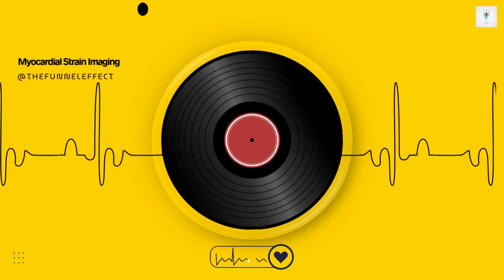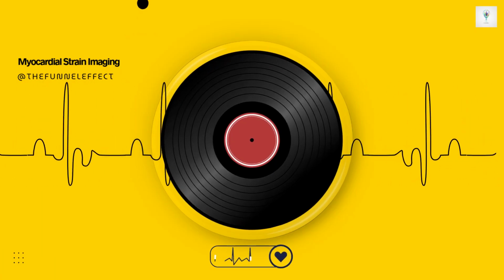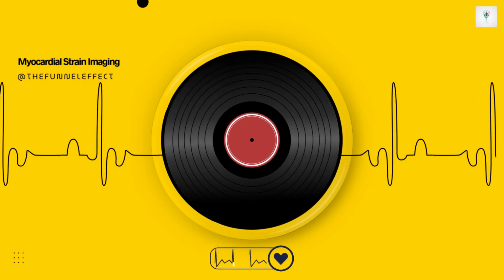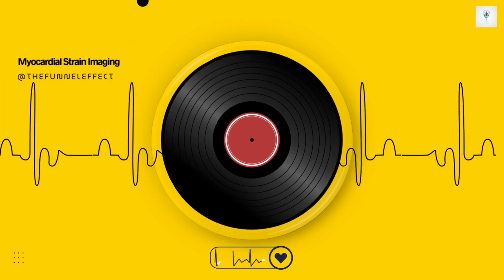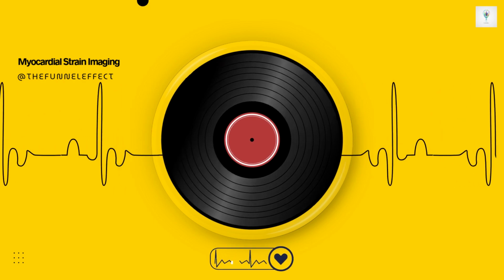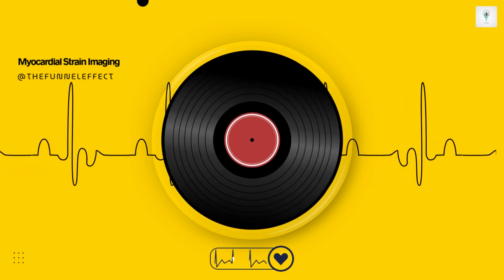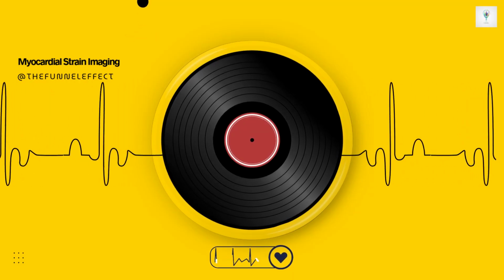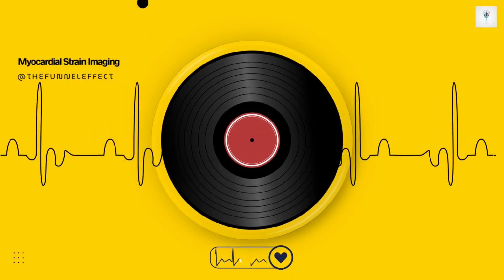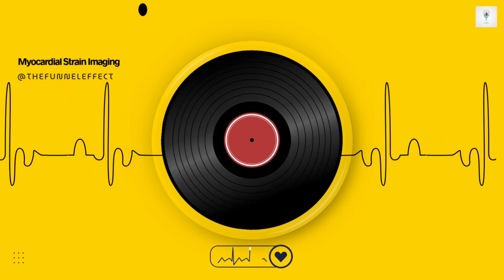Okay, so the damage starts right where the longitudinal fibers, the GLS fibers, live. Precisely. So even relatively mild injury quickly impairs the function of those longitudinal fibers, causing GLS to drop. And because all the layers of the heart wall are mechanically connected or tethered, this reduced shortening in that vulnerable inner layer quickly results in a measurable reduction in overall GLS, long before the damage is widespread enough to actually reduce the overall volume pumped out, which is what EF measures.